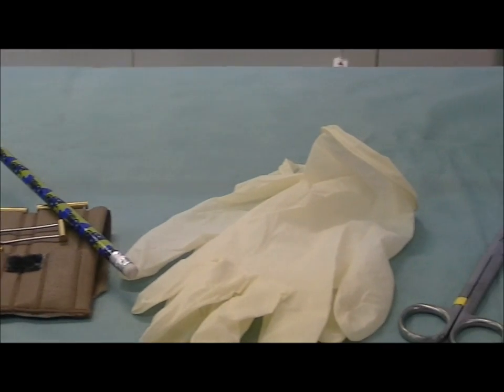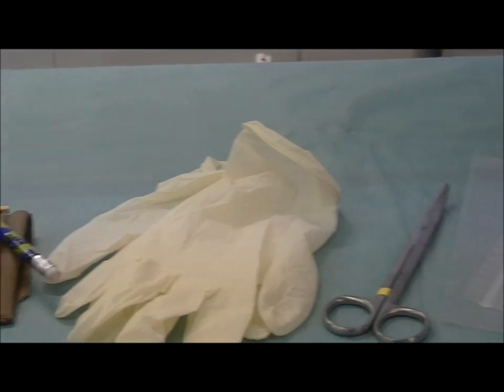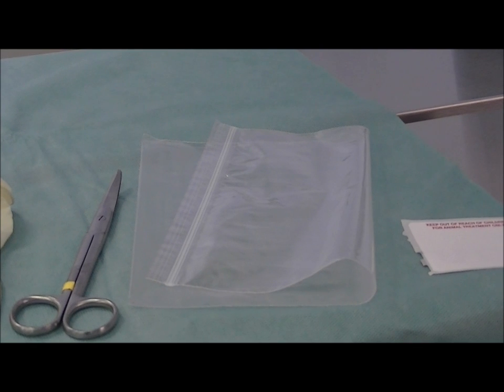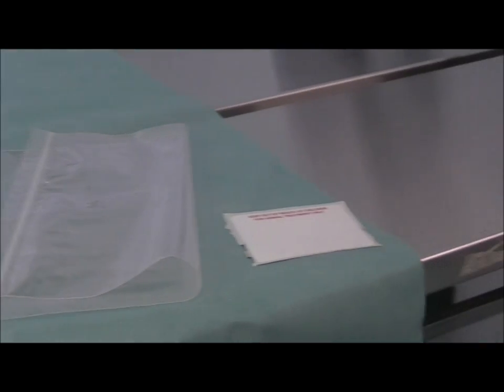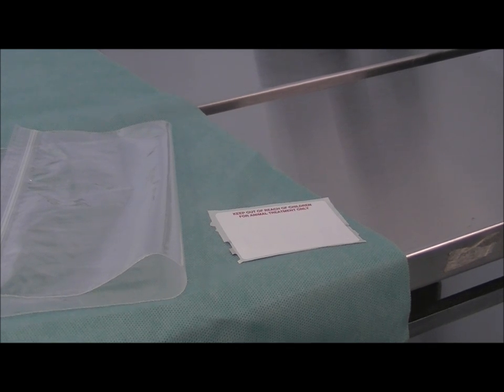You are going to need some examination gloves, which can be purchased from your local supermarket. You are going to need a sharp pair of scissors — they don't have to be surgical scissors, just normal household scissors will do. You are going to need a zip lock bag, and you are also going to need a self-adhesive label to label the specimen container with your name and the snake's name.